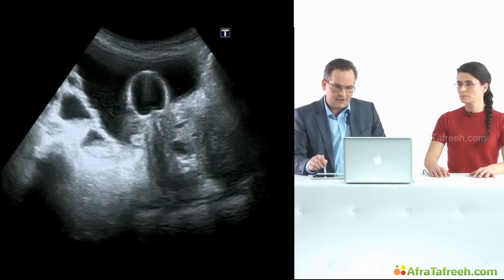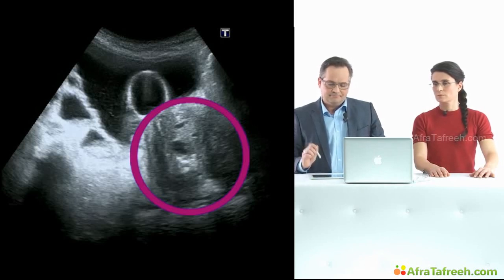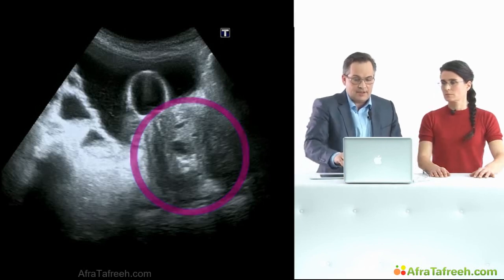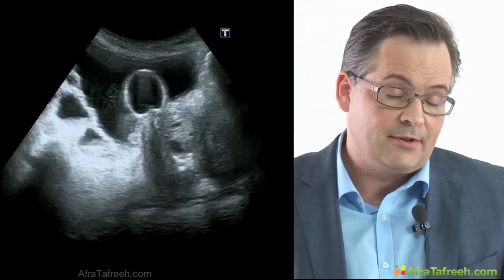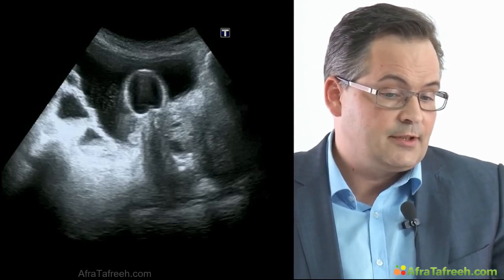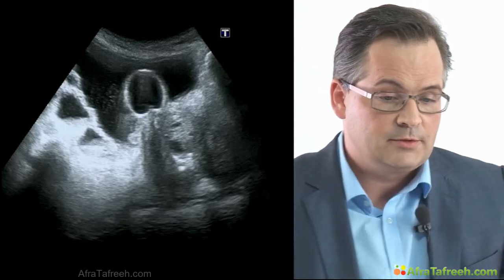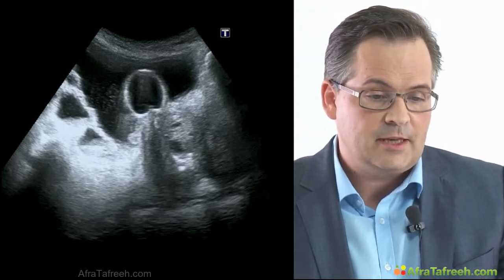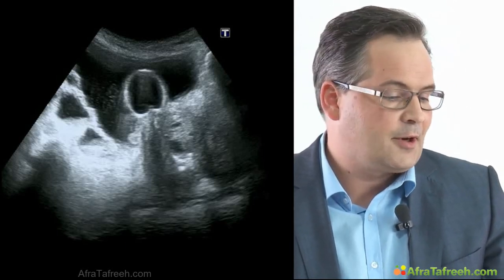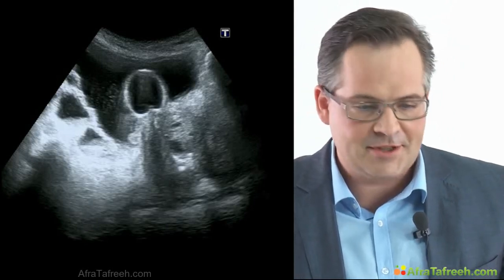And over here, the very immensely enlarged prostate. So, we did it, and it wasn't very difficult to diagnose. It's full bladder and no balloon, so the problem was with the catheter balloon, which was dislocated. Then we could do some more pictures. The patient was already in a quite good condition. Was relieved of his pain. No more pain, so we had some time to make additional scans.